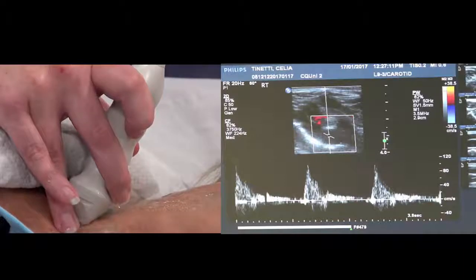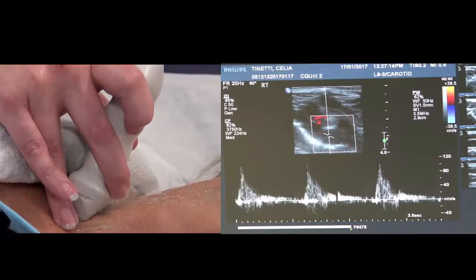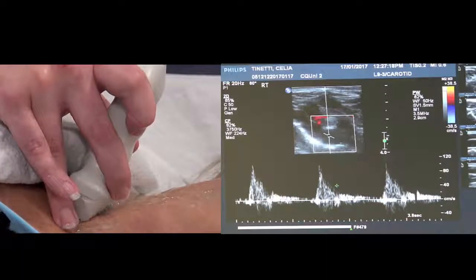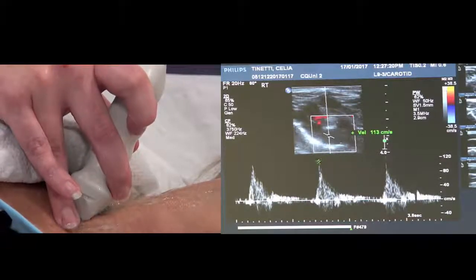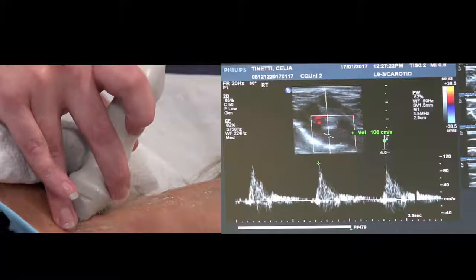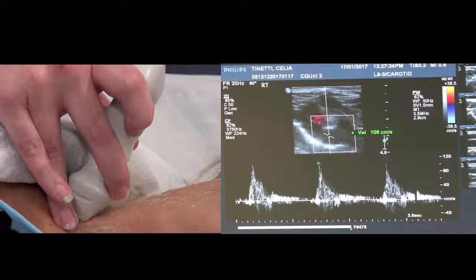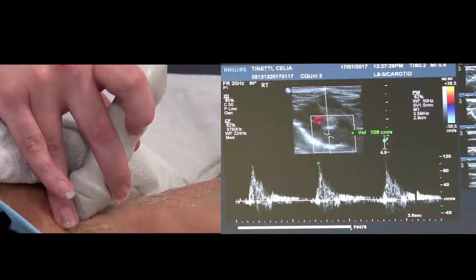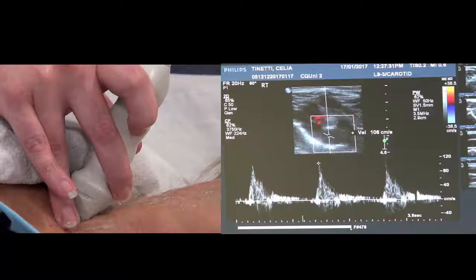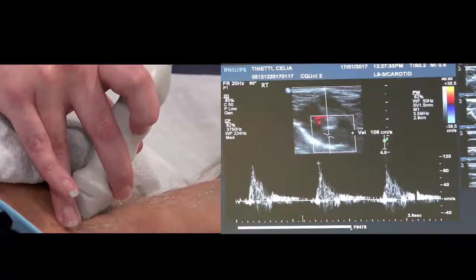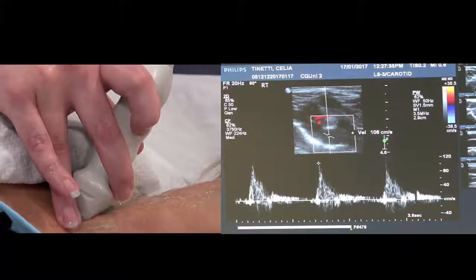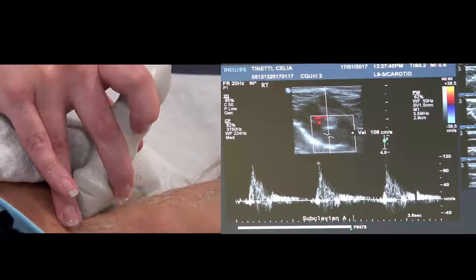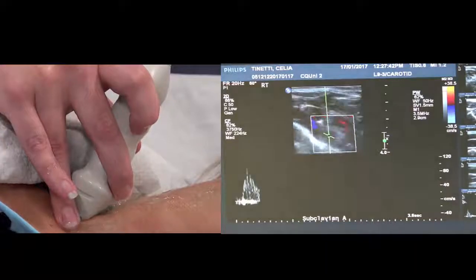So I'm going to take that image. Remember you can scroll through to pick a better image if you've got one. Caliper. Now it's only the one measurement for this — it is a trace that goes below the line so we don't need to see the end diastole. Subclavian is top left on the screen — subclavian artery. So update again.